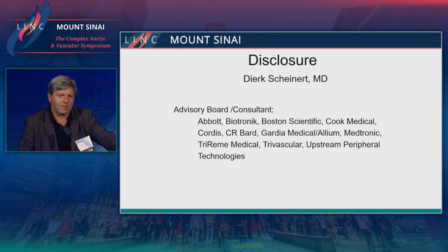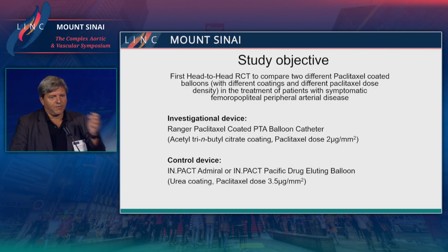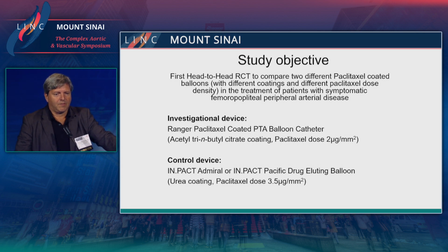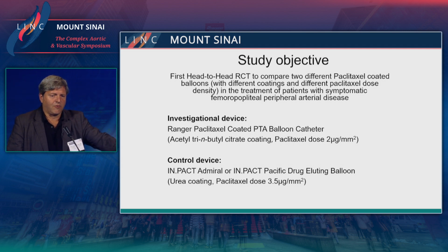And we all know that, of course, it's very difficult to make cross comparisons between different studies. That's why I think what the field really needs, if we deal with new devices, is that we go for head-to-head comparisons. It's difficult to conduct in the field of medical devices, but I think it's the only way to really understand whether devices do really differentiate in their performance.